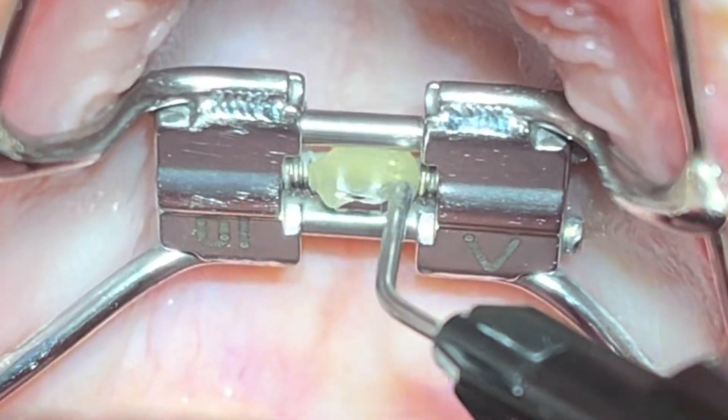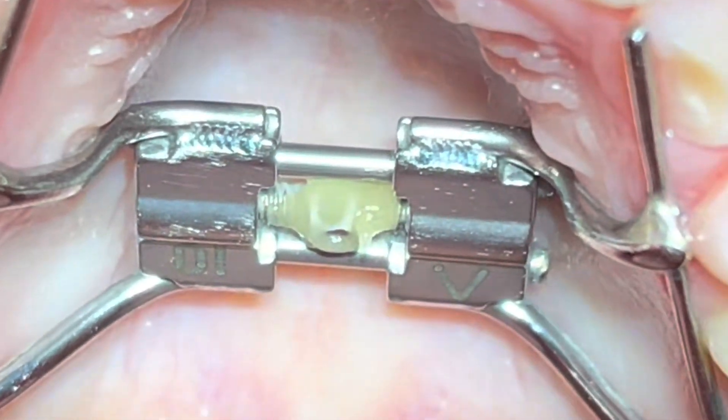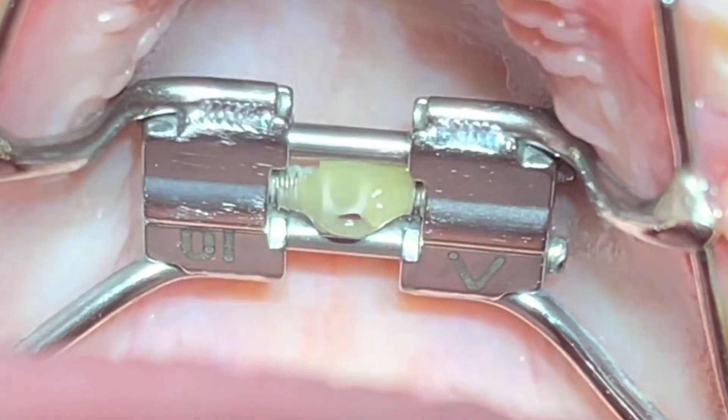For retention and to prevent the screw from turning back, we put flowable composite to secure the expansion. We should leave it for around four to five months for retention.